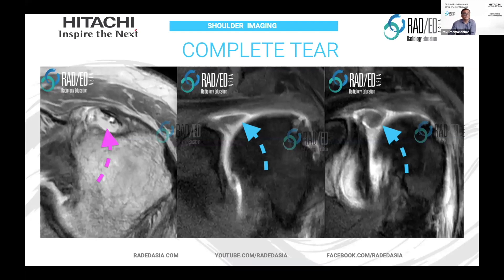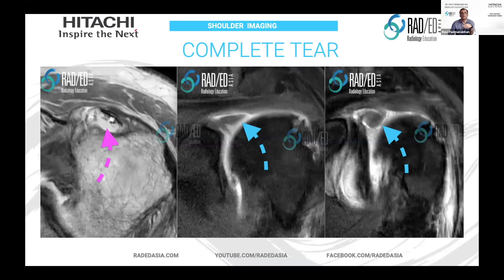The tendon sheath is still within the bicipital groove, so this doesn't mean it's a dislocation — the biceps tendon hasn't dislocated, which is why you're not seeing it. This is really all you need to make the diagnosis, but what we do is actually try and find the ends. When it ruptures, it's usually not ruptured from the attachment at the supraglenoid tubercle. The rupture occurs within the tendon itself, usually the intra-articular portion because that's where you get a lot of tendinosis. Often we'll see a little stump — this is the residual stump of the tendon. The distal portion you may or may not see because it can pull down out of our field of view, but generally you'll be able to find the proximal portion.